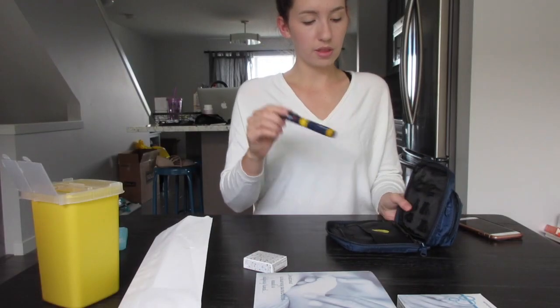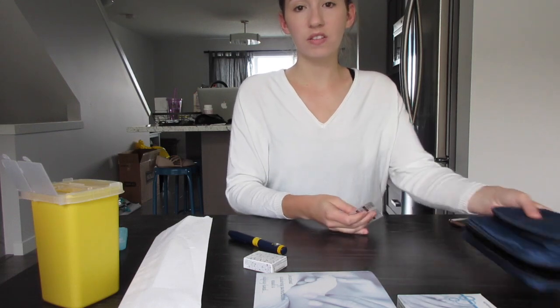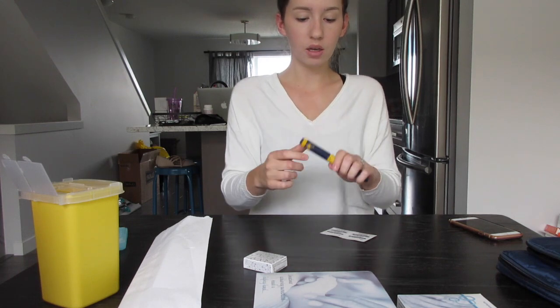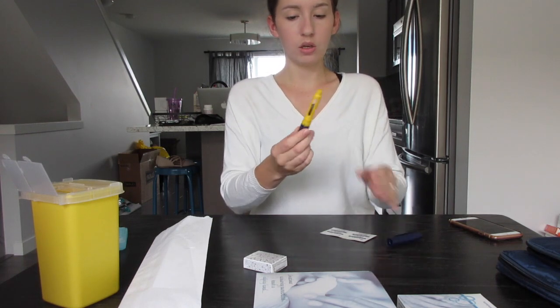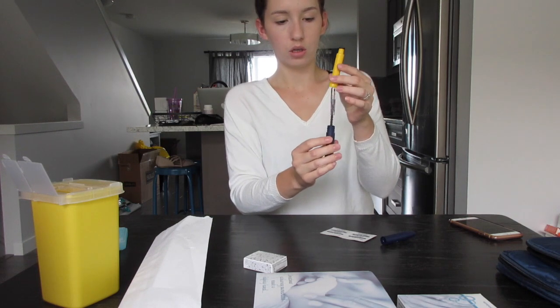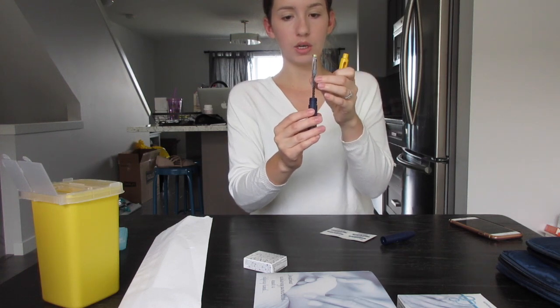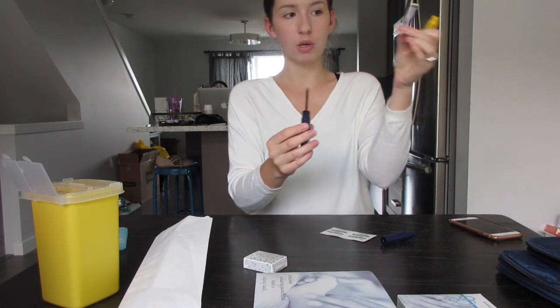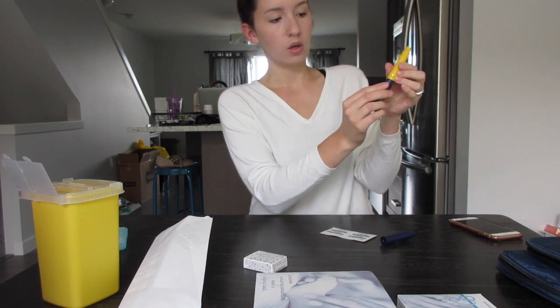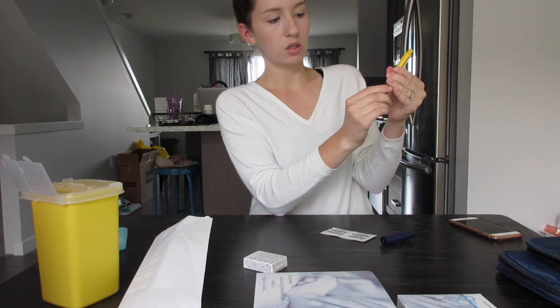So let's start with the Puregon pen. This one is fairly simple. So what you're going to need is your pen. You will need your cartridge. This is the cartridge. So you'll put it in, mine is already in, but you'll basically just put it in here, put the lid on, you push down and you have this little arrow. You want to turn it all the way.